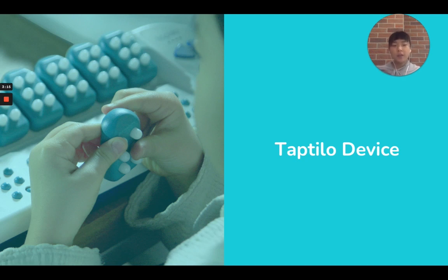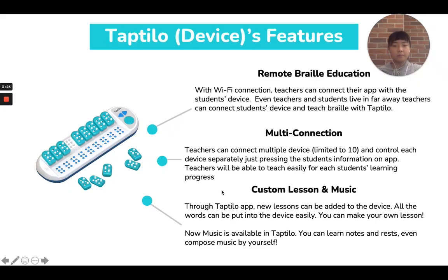So, I finished introducing the advantages and impact of Taptilo, and I'm going to introduce the Taptilo device from now on. Taptilo has these kinds of features with the device. As introduced before, remote Braille education is available. With Wi-Fi connection, teachers can connect their app with students' device. So even if teachers and students live far away, teachers can connect to students' device and teach Braille with Taptilo. When students make the answer with Taptilo, teachers can check if the answer is right or wrong with their app.